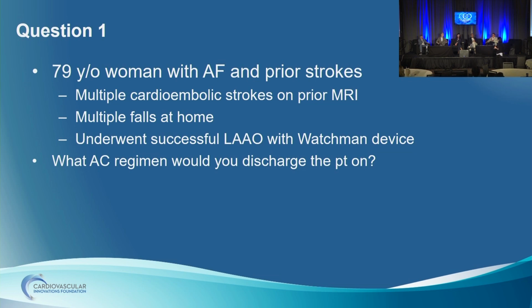Correct. For our institution as well, we actually put DAP for 6 weeks. And probably for the first Watchman trial, the 6-week anticoagulation is probably a carryover, because there was a comparison to warfarin in the other arm, so it may be partly carried over rather than truly evidence-based.